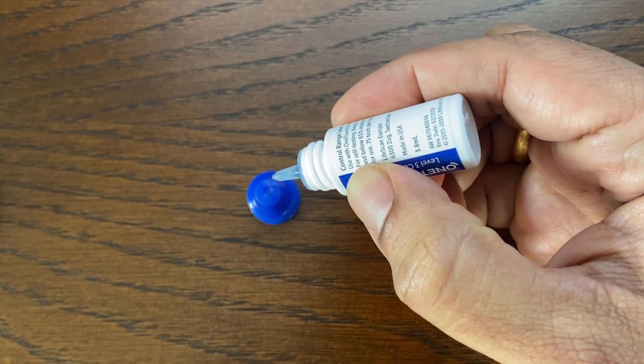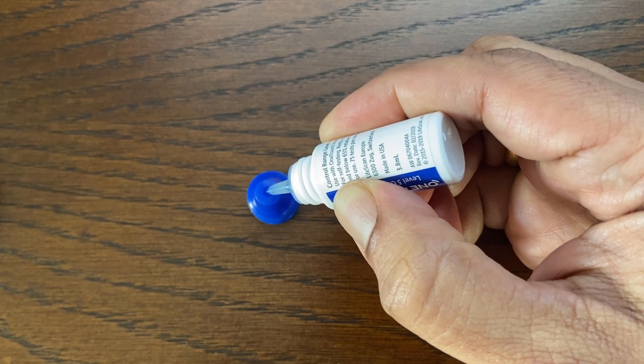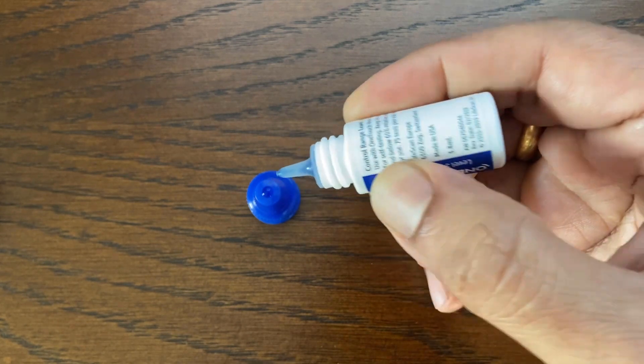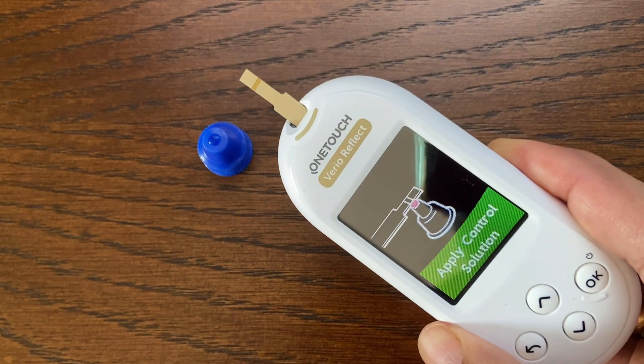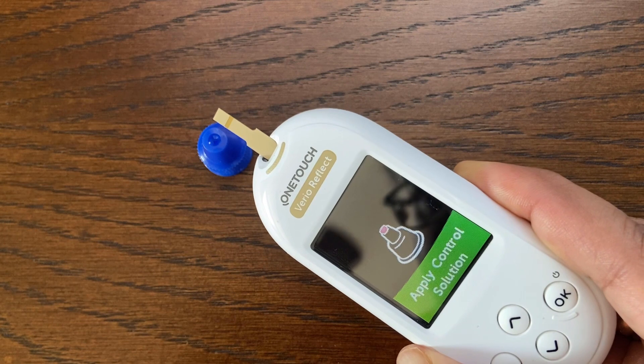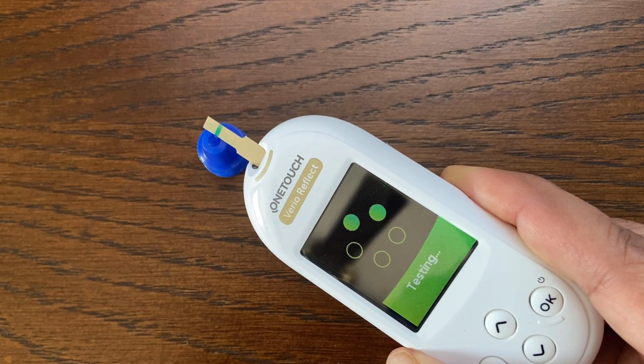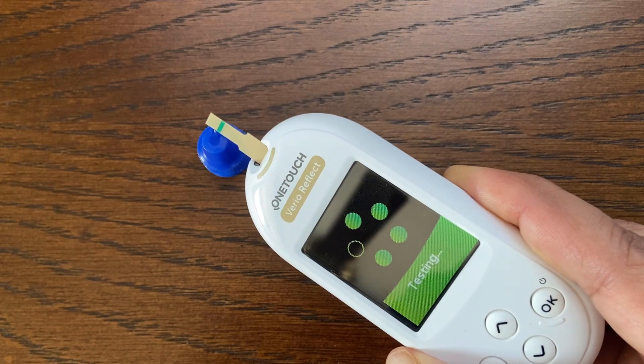Next, squeeze a drop into the small well on the top of the cap, or onto another clean non-absorbent surface. Touch the channel on the side of the test strip to the control solution and wait for the channel to fill completely. The meter counts down for five seconds before displaying the control test result.